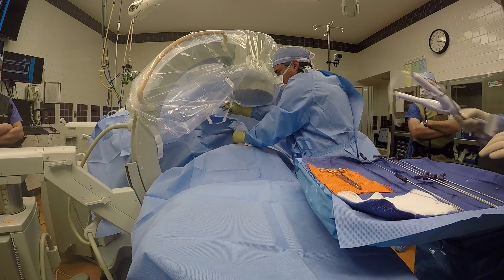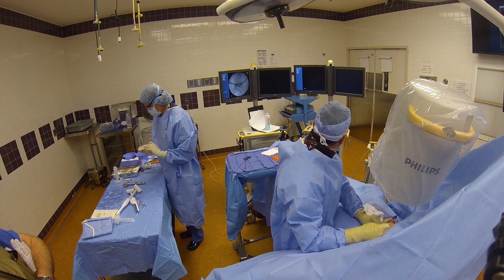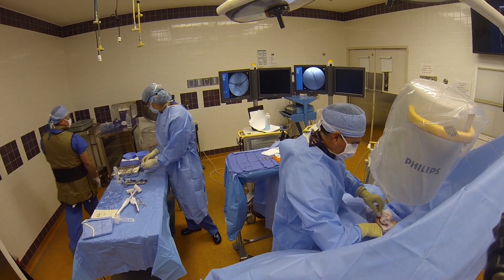Once the cement has been injected, the trocars are removed and the puncture sites are closed with glue. The patients don't report pain during the procedure, and most report significant pain relief by the time they reach the recovery room.